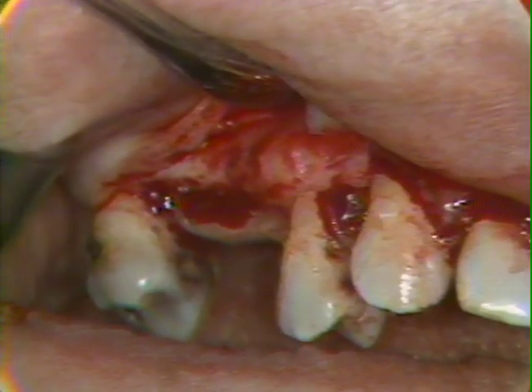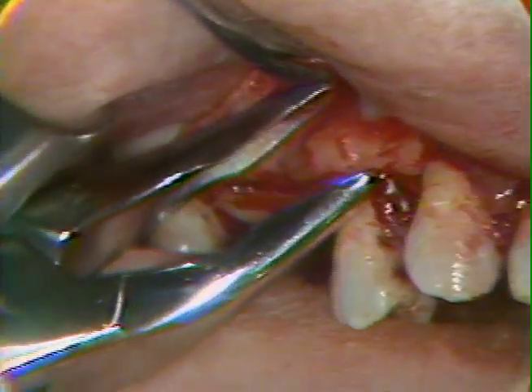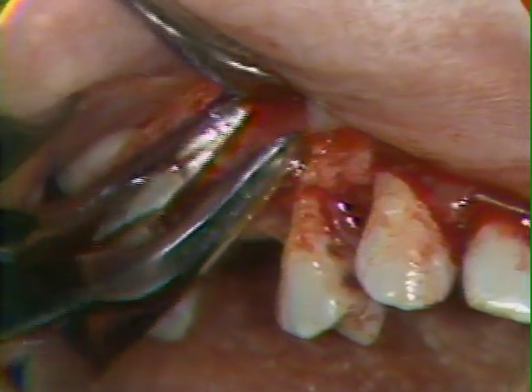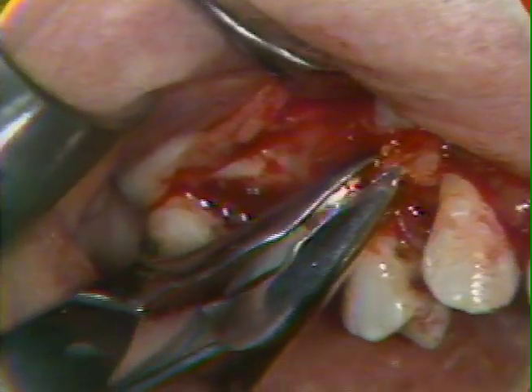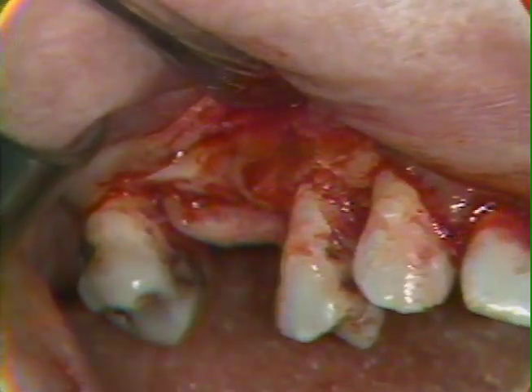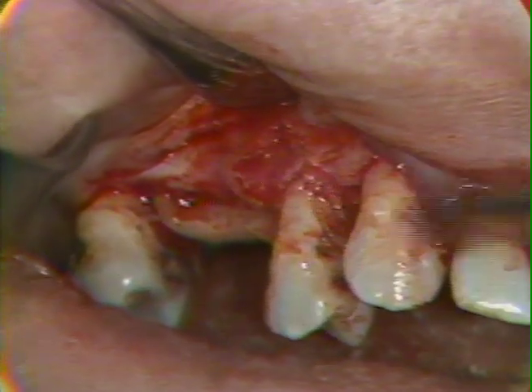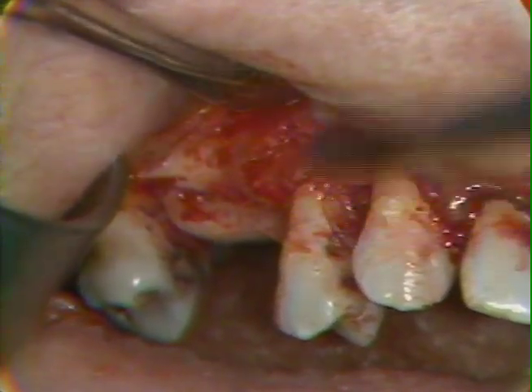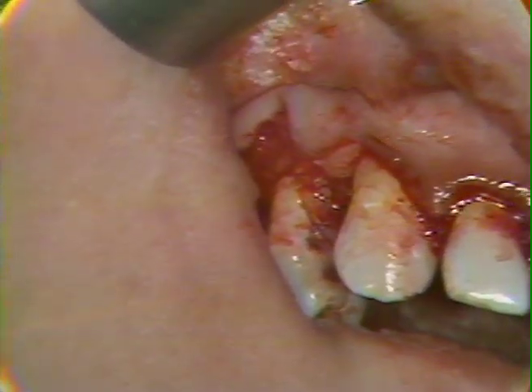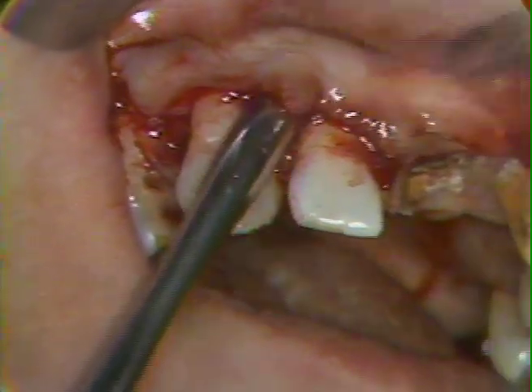Down below, we demonstrated the use of the rotating instrument. Here we can place this Rongier with the beaks in that manner and contour some of the undercut bone away. Now, that's an area that would have to be contoured anyway, so that it is not sacrificial of bone support. We can look here with a little more adequate flap reflection at the bone overlying the cuspid as well, and we'll try to reflect that flap up slightly.